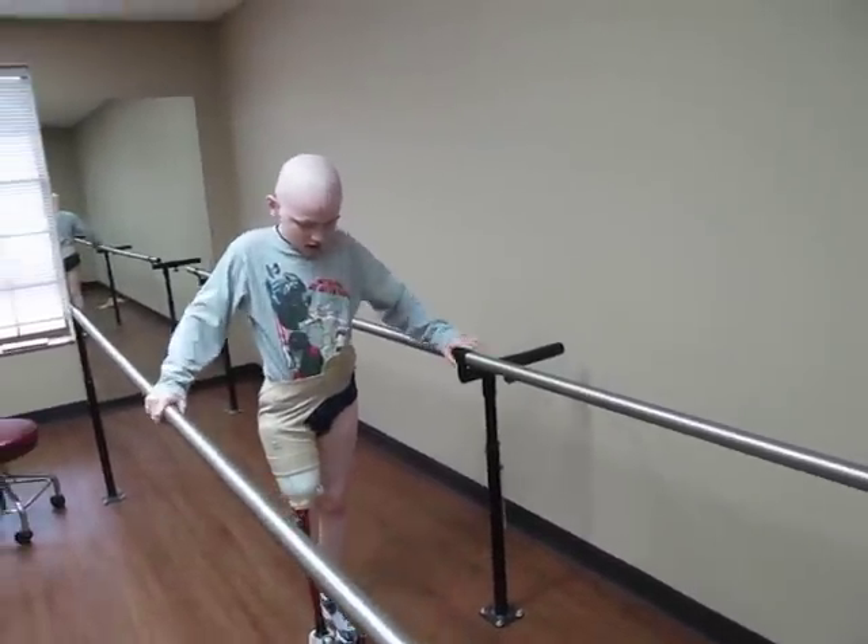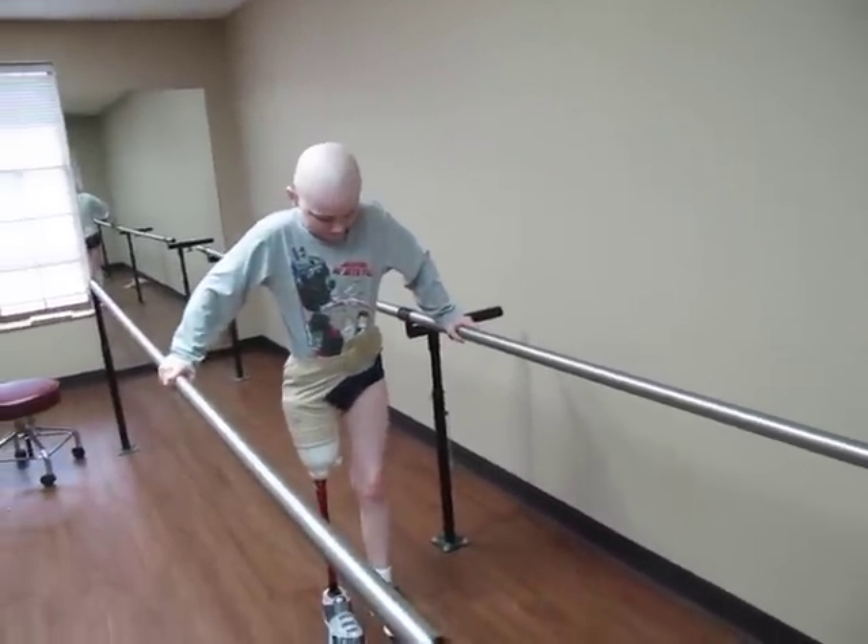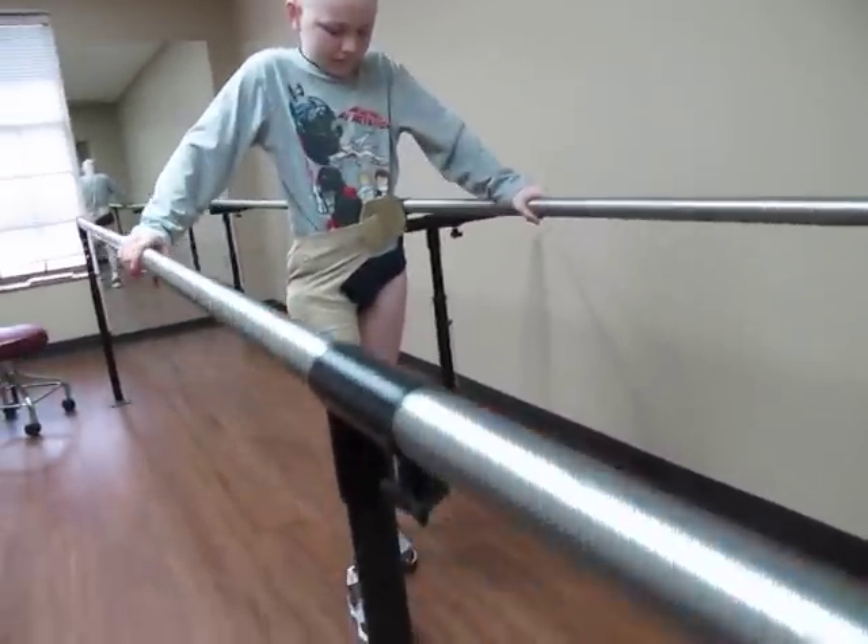Well, that foot — he couldn't find a bell for me. That is a hundred percent better. A hundred percent better. You know, that foot would be great for him when he gets going. Yeah, eventually.